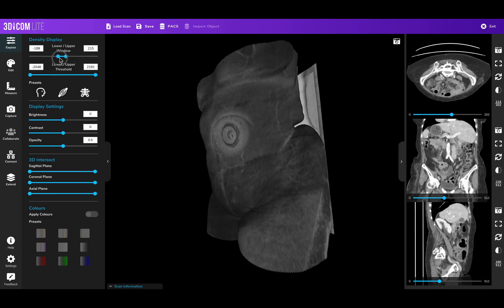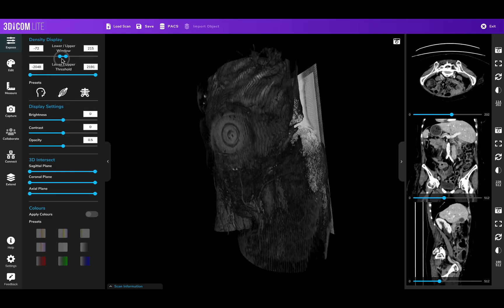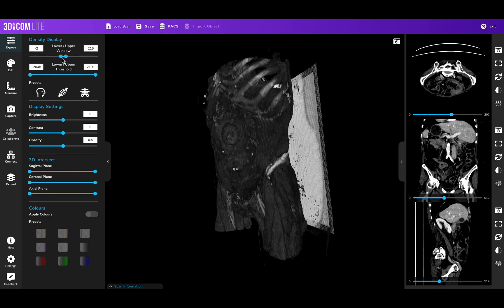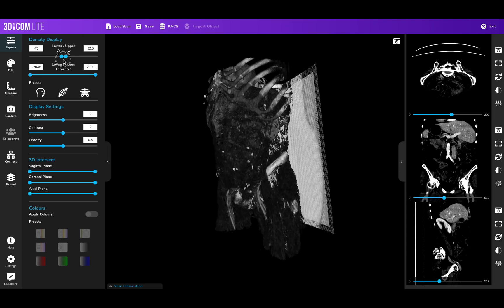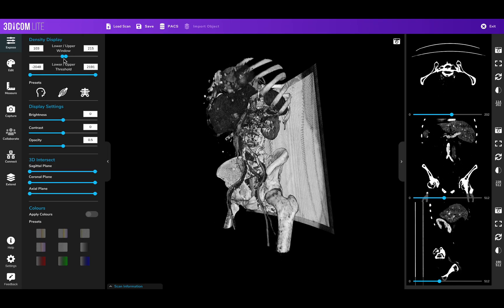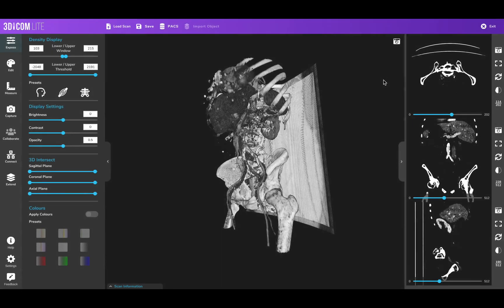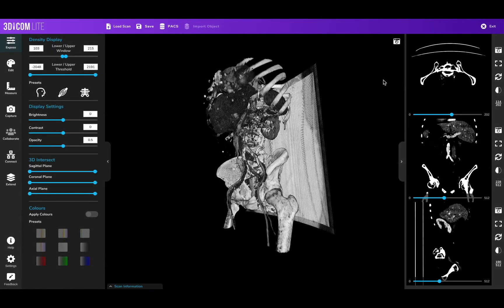We can further strip away some of the skin here and have a look at the bone. We can take a screenshot of that, and this can be easily communicated.